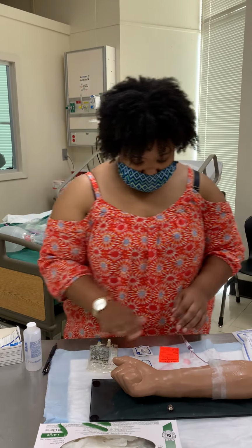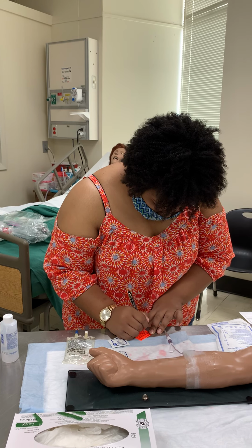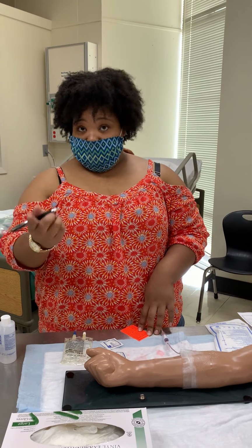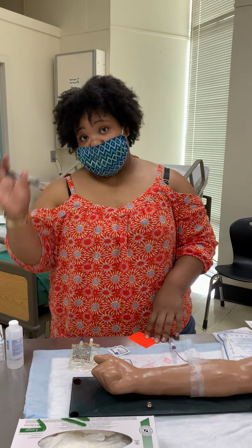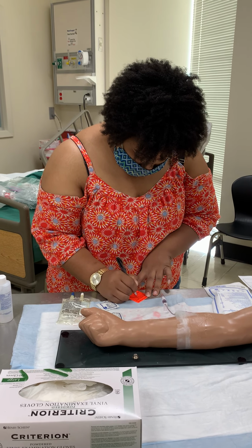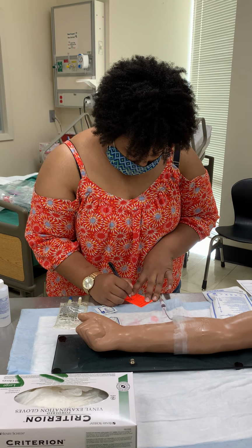and I need to label. So I have gentamicin 60 milligrams, and if it were by pump, it would be 100 milliliters or 17 drops by gravity. Okay, I'll put the date and time.